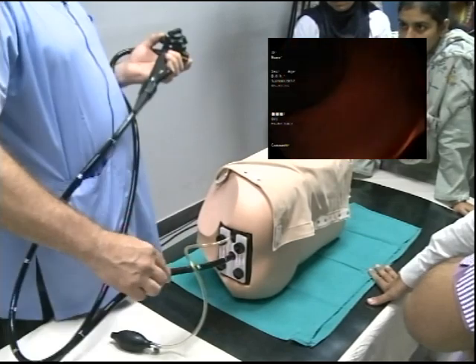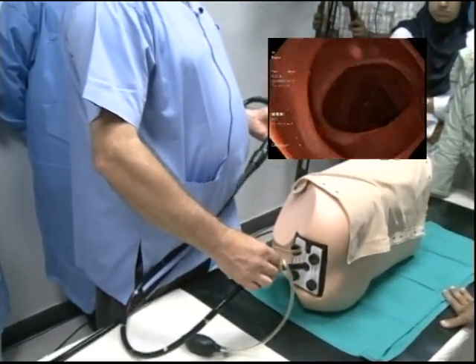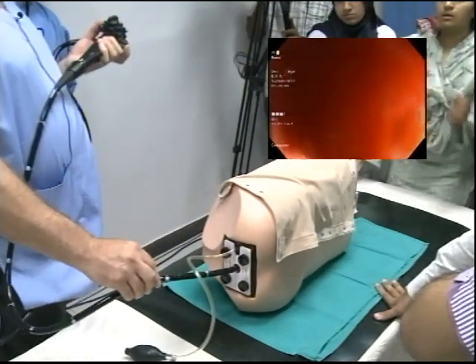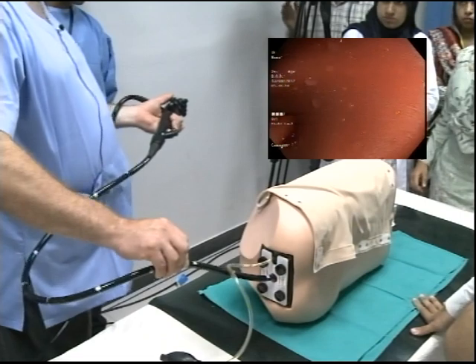You've got to be mindful, because this is Pakistan, and moving ladies around can be a little bit more compromising. So I wouldn't want to actually move a lot of ladies around in these positions. I try to actually be as successful as I can in one position or the other.